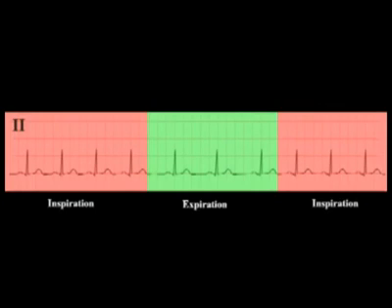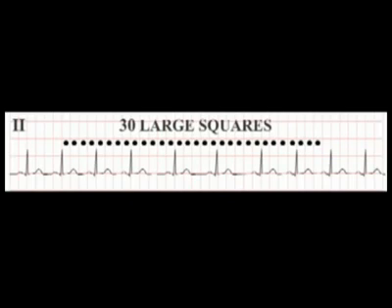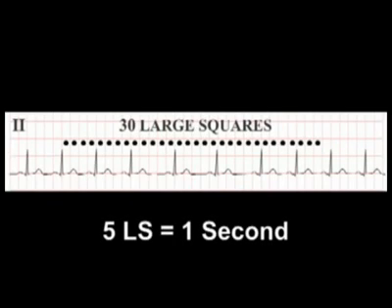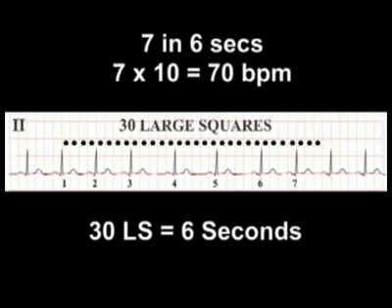When calculating the heart rate from an ECG in the presence of an irregular rhythm, count out 30 large squares. Remembering that five large squares equates to one second, 30 large squares corresponds to six seconds. Count the number of R waves in these 30 squares — in this case there are seven. Seven beats in six seconds gives a heart rate of 70 beats per minute.